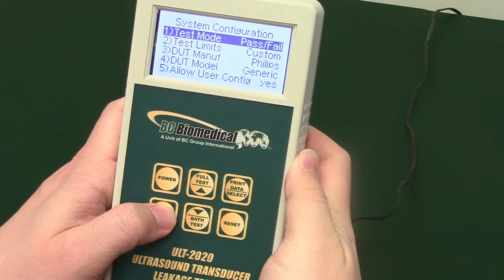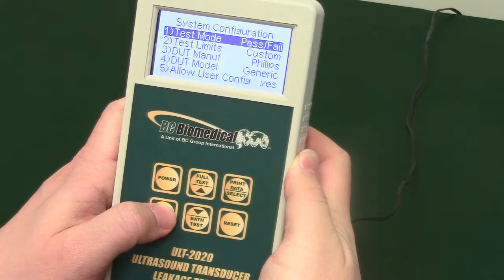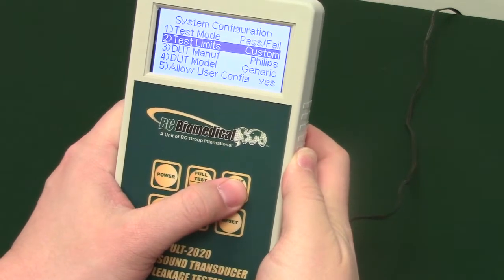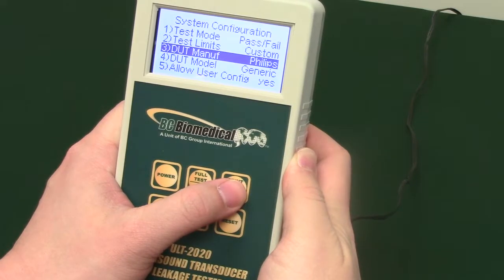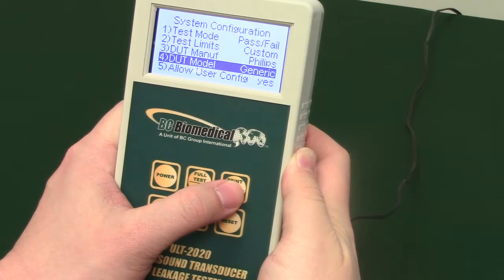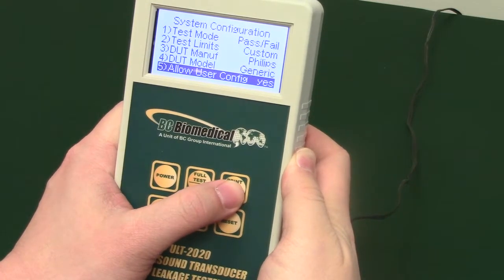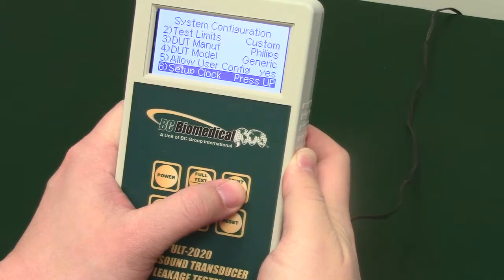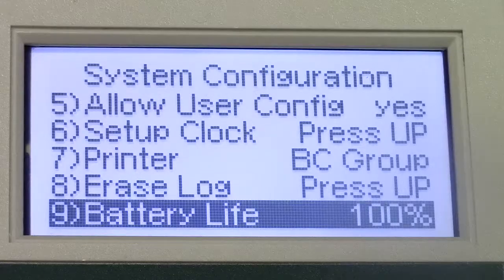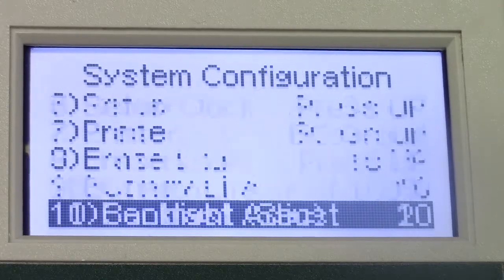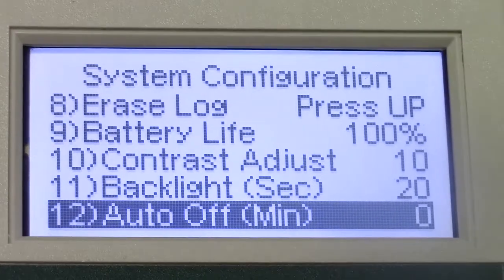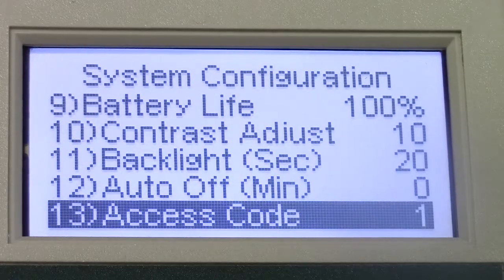Press Select to select different options and use arrow keys to adjust the highlighted area. Users can adjust: test mode, test limits, DUT manufacturer, DUT model, allow user configuration, setup clock, printer, erase log, battery life, contrast adjust, backlight, auto-off, access code, and software.